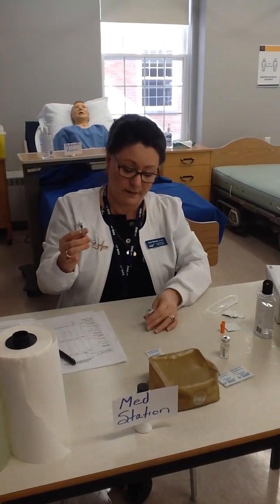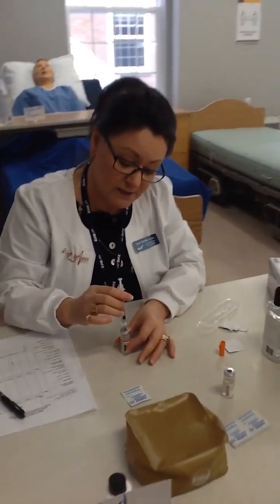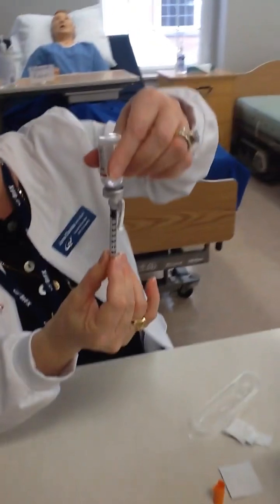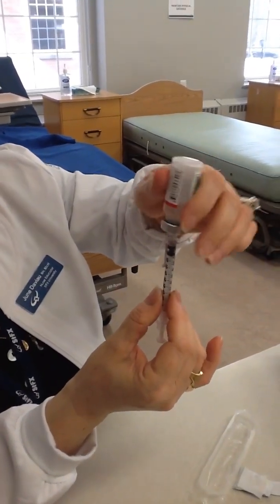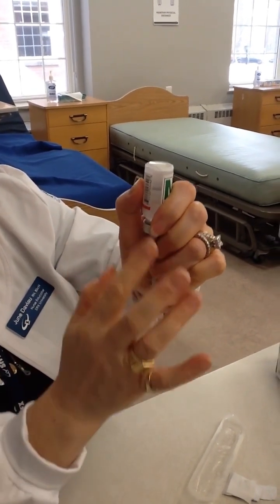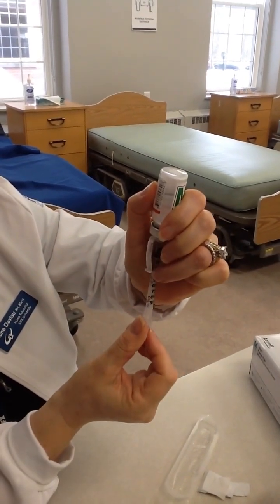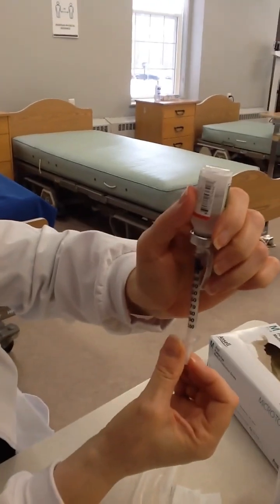Now I'm ready to go to my second drug, and I'm going to draw up the remaining 14 units for a total of 20. So my syringe is going to end at 20. So I'm going to very carefully just invert everything. I have my cloudy here. You can see it's cloudy. And I'm going to stabilize the whole unit. You can see how I'm keeping everything nice and straight. And that just comes with practice. And I'm going to go ahead. I'm going to turn this just so I can see. And I'm going to very carefully draw that.